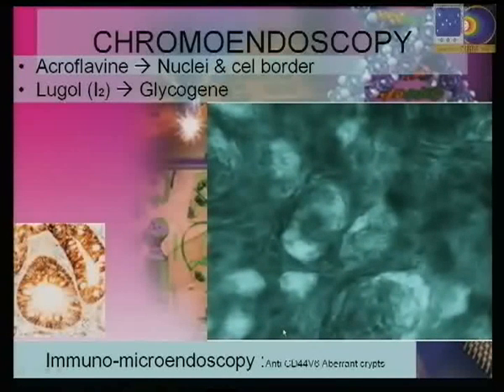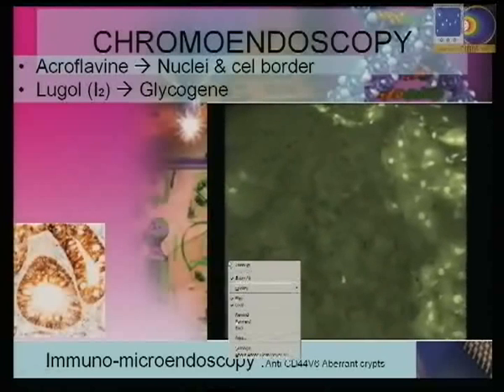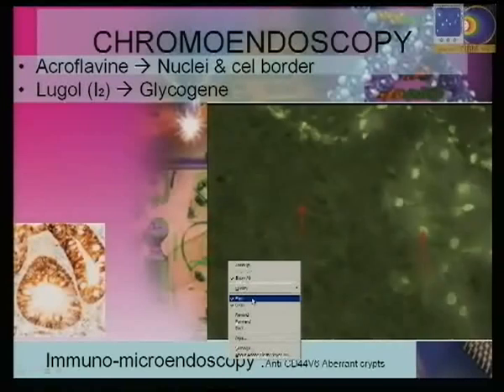Here, the tumor vessel seen after the application of fluorescein is further magnified and colorized. Malignant, irregular and dark changes are seen in contrast to the bright normal cell architecture of squamous epithelium after local acroflavin application. In the magnified mode, single cells with normal nuclei are marked with an arrow at the right. The malignant changes are highlighted with a second arrow at the left. Endomicroscopy-guided biopsies revealed a poorly differentiated squamous cell cancer.